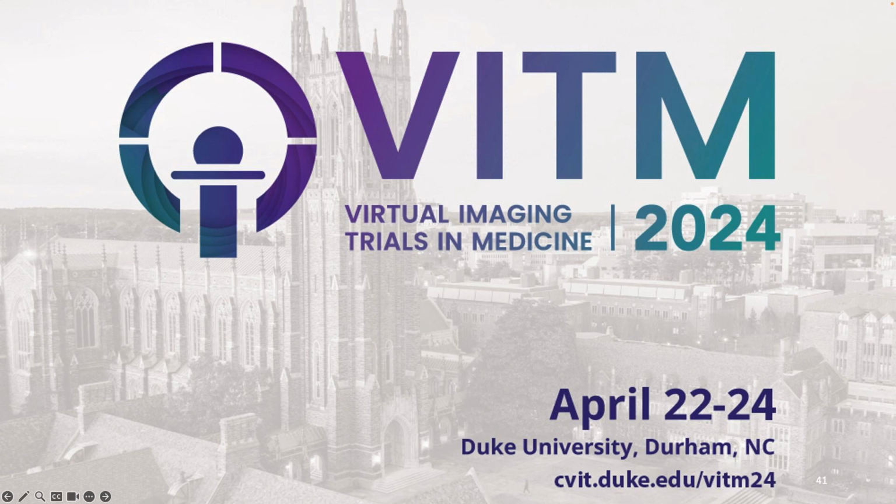Thank you again, Yazdan. Is it possible to save the raw data by DukSim? Yes, DukSim actually saves the raw data for you. We also have reconstructions that you can use to reconstruct your data, but the main output of DukSim is sinogram images.